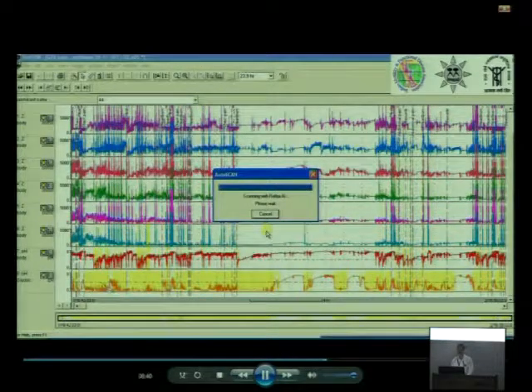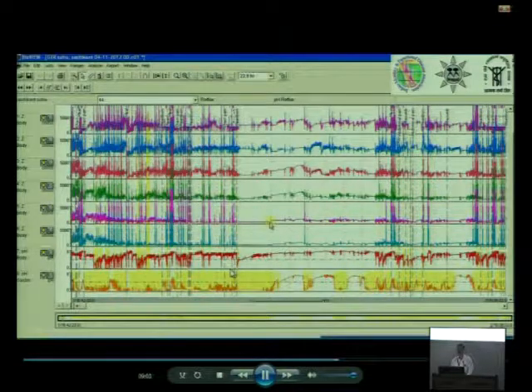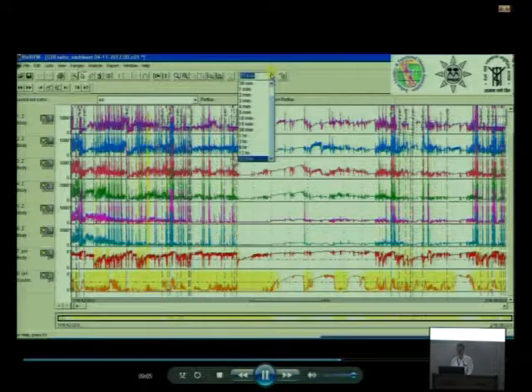And if you see there is a dotted line, this dotted line is for pH 4. Why pH 4? Because pepsin works best below pH 4, that's why they have put pH 4 as the cutoff. Now you see, look at the gastric pH, much of the time it is below pH 4. Look at the esophageal pH, much of the time it is above pH 4, but there are drops in between and these are reflux episodes. So this is a total 23.9 hour record.